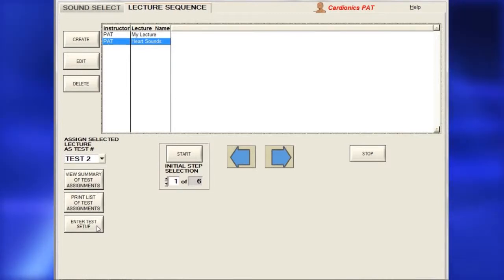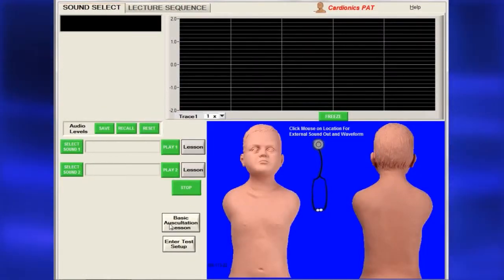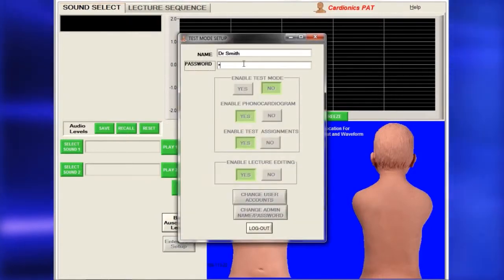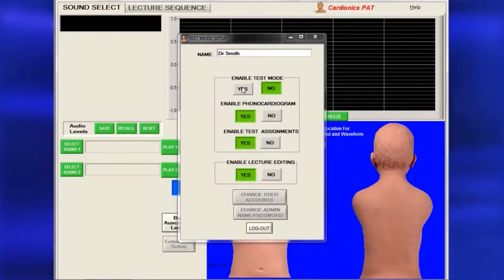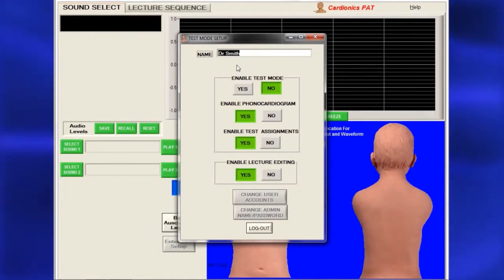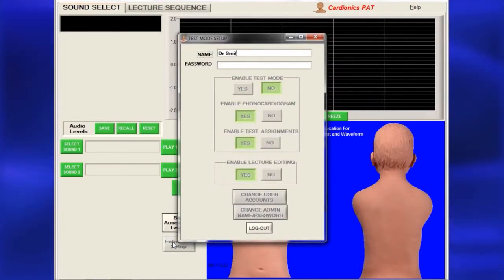On either the Lecture Sequence page or the Sound Select page, click Enter Test Setup. Enter your name, then click Enable Test Mode. To prevent your lecture from being edited, click No in the dialog box of the Test Mode Setup. To edit your lecture later, simply open the dialog box again and click Yes.